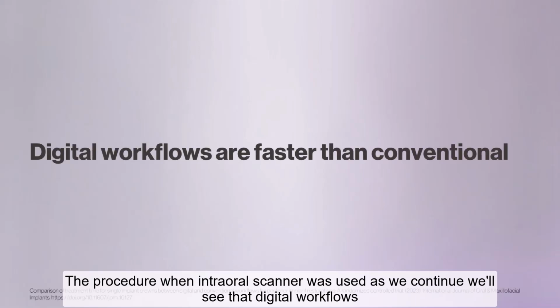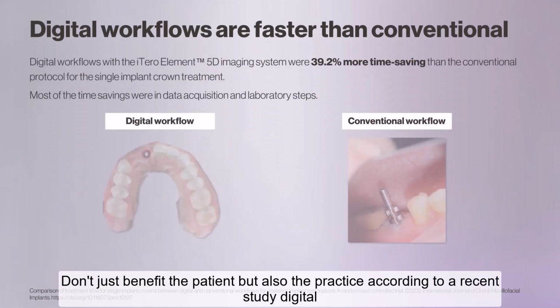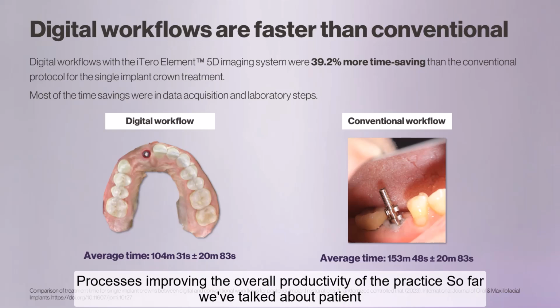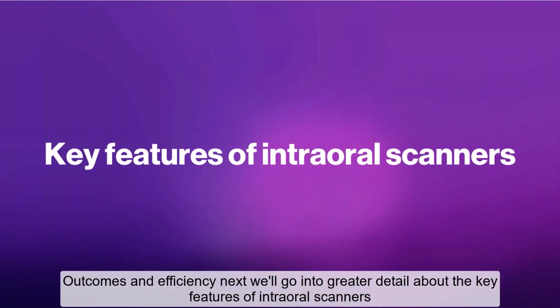As we continue, we'll see that digital workflows don't just benefit the patient, but also the practice. According to a recent study, digital restorative workflows using iTero scanners for single implant crowns are 39.2% faster compared to conventional methods. This efficiency stems primarily from data acquisition and lab processes, improving the overall productivity of the practice. So far, we've talked about patient outcomes and efficiency. Next, we'll go into greater detail about the key features of intraoral scanners.